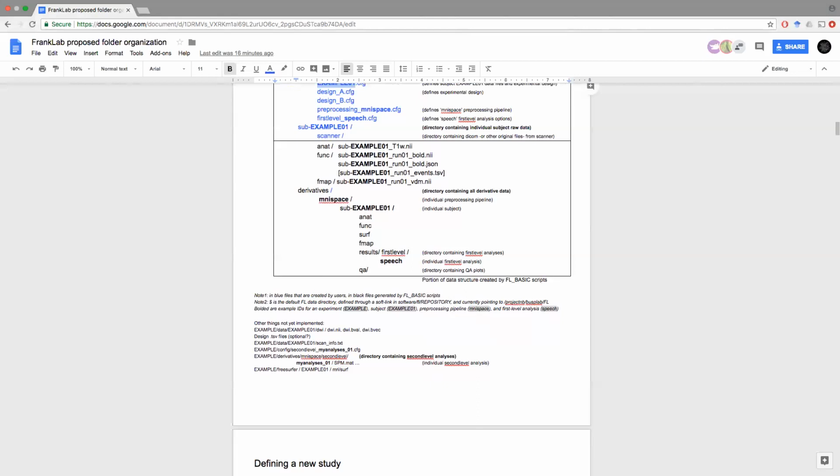Then it does some tricks to the volume, like trying to normalize the white matter intensity and things like that as it gets processed along. So the T1 volume would have that. Have you looked into whether or not that adversely affects the registration? And which one is the file that should have the intensity normalization step? I didn't get the name.